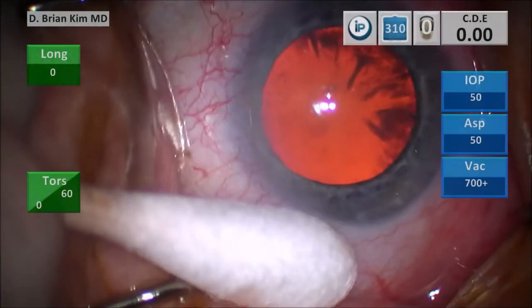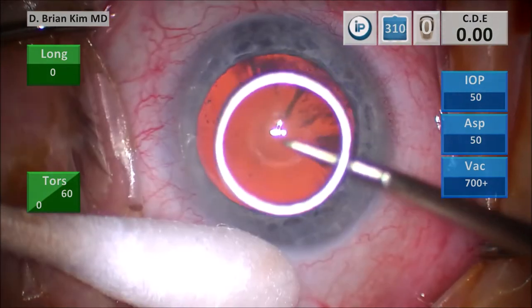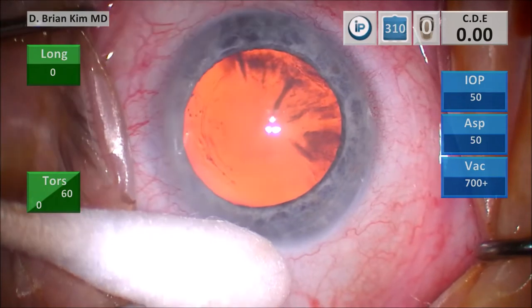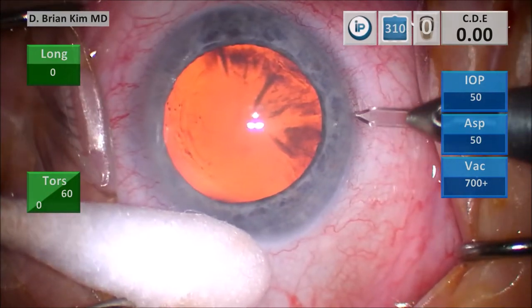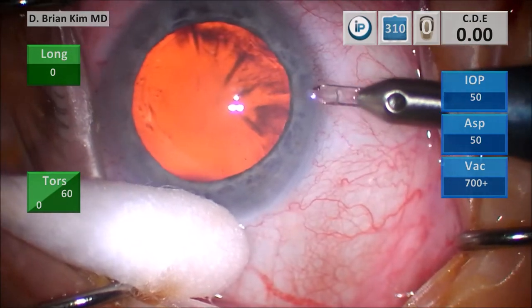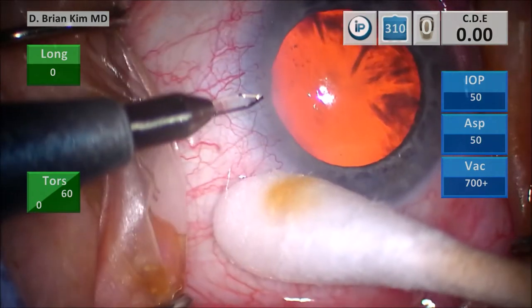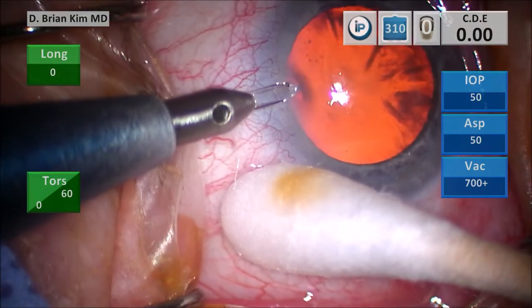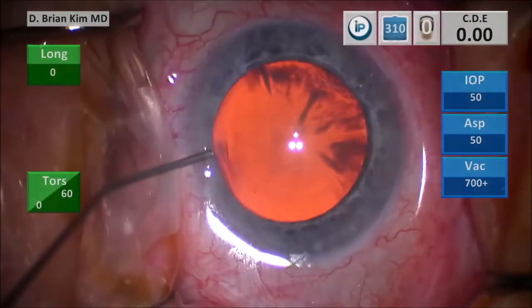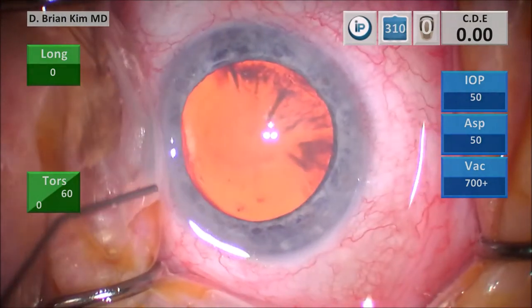I use a cotton tip to stabilize the eye. The patient has some eye movements here. I'm using a corneal marker, which will help me to center inside the rhexis. This is my paracentesis blade. I'm going to make an incision first on the right side and then the left side, making sure that the incision is parallel to the iris plane, which creates a nice corneal shelf, allowing me to achieve a self-sealing corneal incision. There's quite a bit of oily material on the surface of the eye, and I always try to remove all that oily material first before I get going with the case.